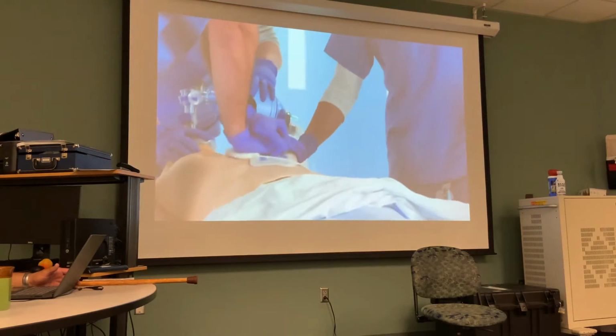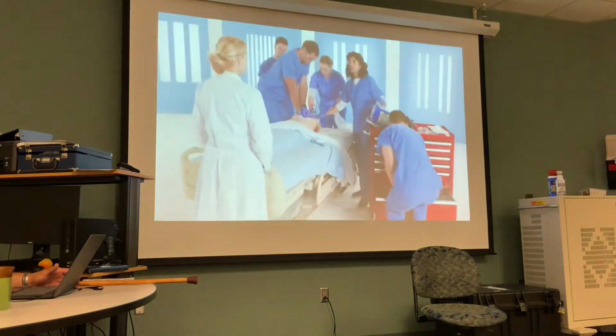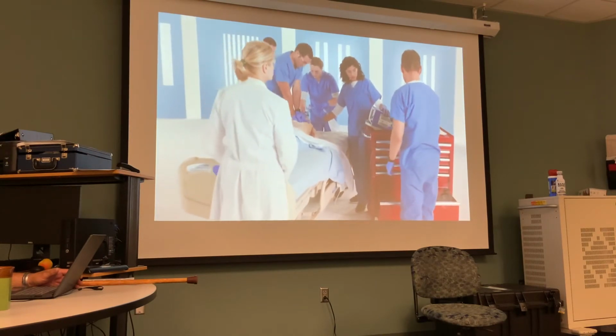Now that the CPR coach is in place, they should verbalize the data from the feedback device, providing corrective and positive feedback, such as "Push harder" or "Your rate is good. Great job. You're right on target."